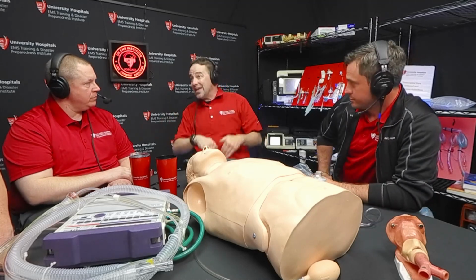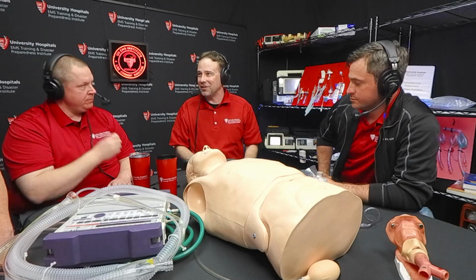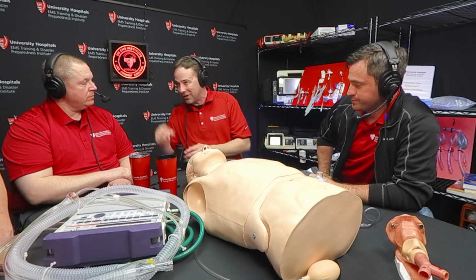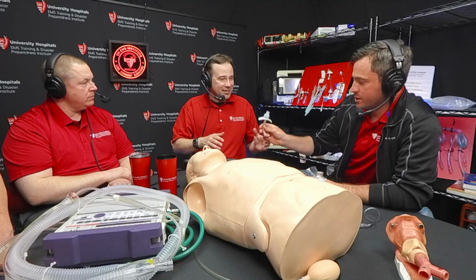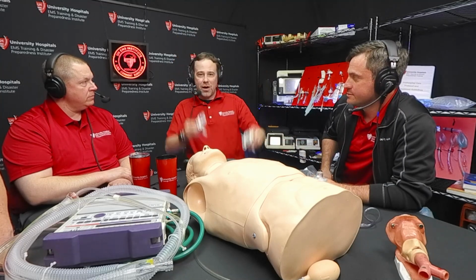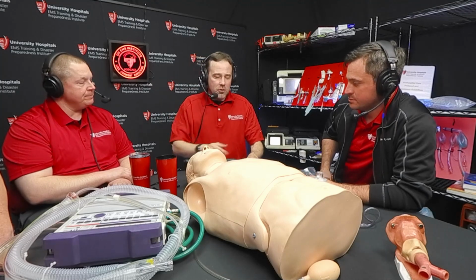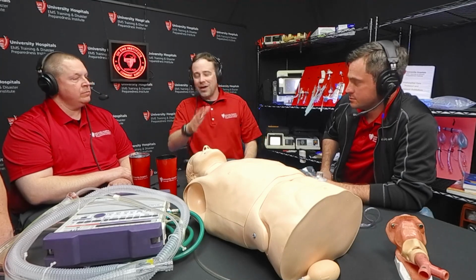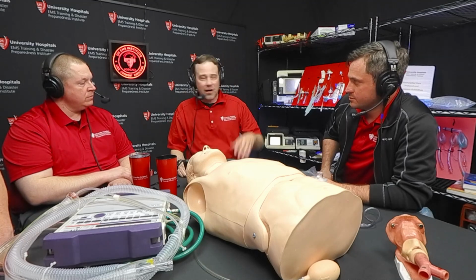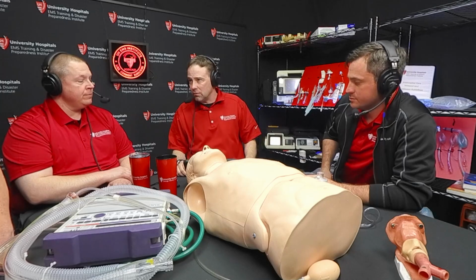So first of all, if you're in a facility that has tracheostomy patients, I think the easiest thing to do and the most overlooked thing to do, because everybody wants to do the cool thing, is just ask. Hey, here's the size of this. Do you have this size cuffed tracheostomy? Can you bag them for a minute or two? That'll buy you enough time, right? Let somebody go get it for you. Make everybody's lives downstream much easier, right?